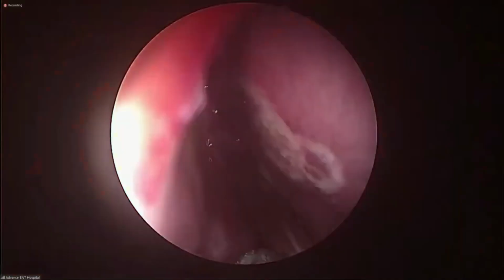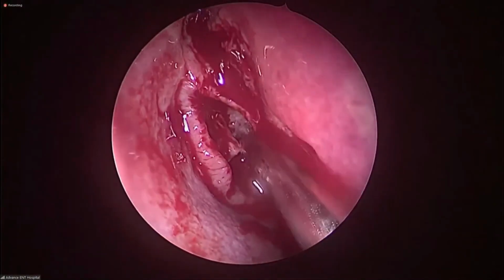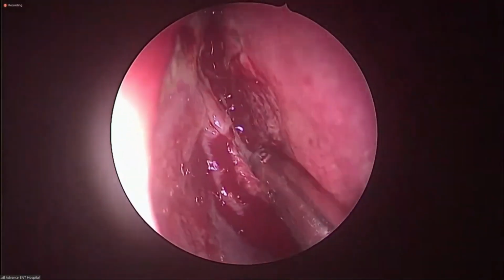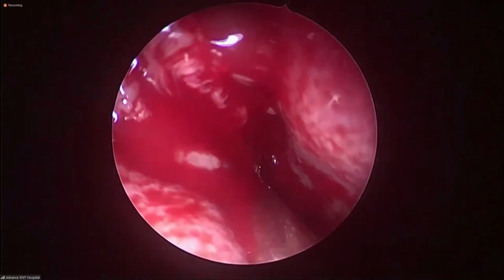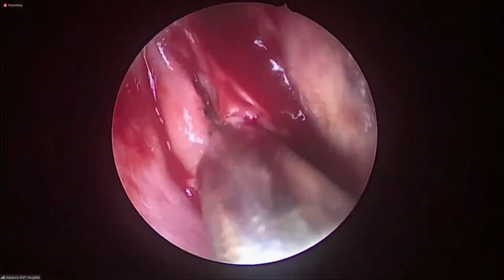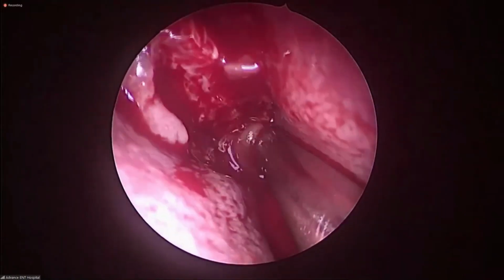Yes, now I can see. That looks like this middle is the turbinate, uncinate process. Yes, sir. This is the axilla and the middle turbinate. Can you see? Yes, sir. Bony part of the middle turbinate. Yes, sir. And see a lot of disease medial to it. See that? A lot of disease in the olfactory cleft. Yes, sir.